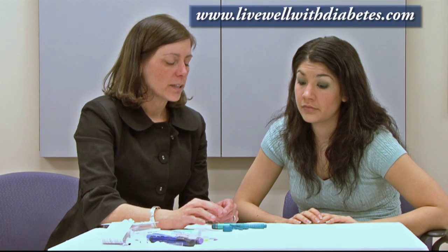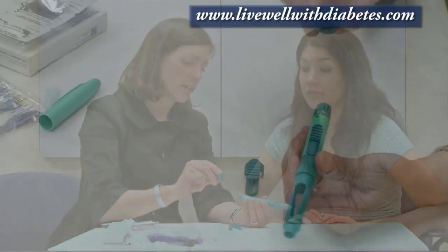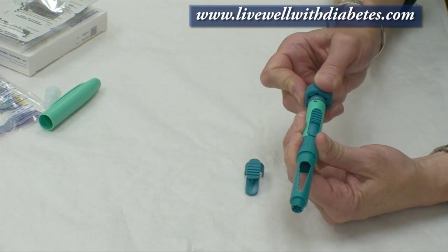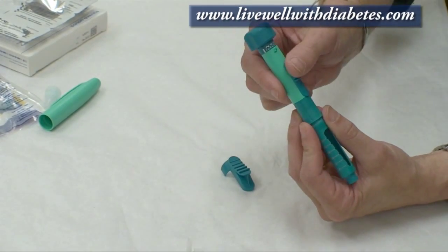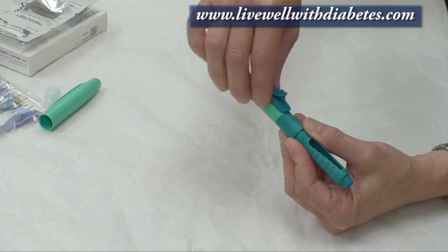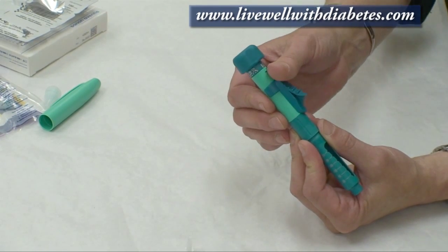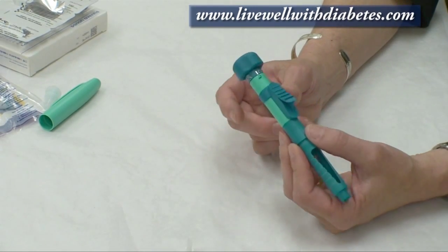There are two added pieces that are extra for the Auto Pen 24, used as needed or desired. One piece fits over the end of the pen so that when you turn the dose it's easier to hold on to. The other piece clips over the slide button area — it's on a grade and more ergonomic for your thumb, making it easier to push the button down.